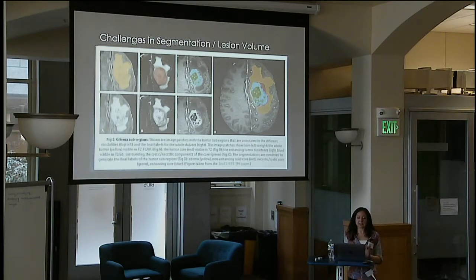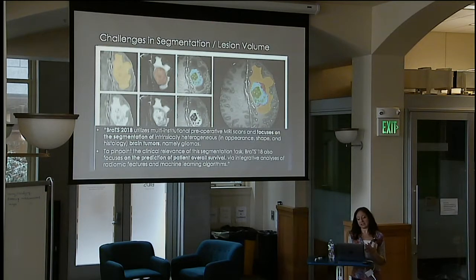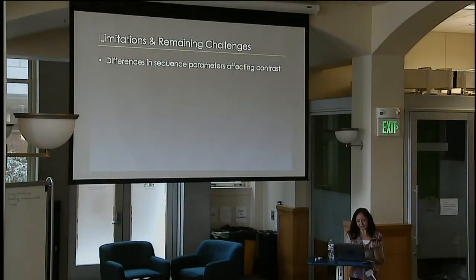But in the last, some of the limitations inherent in this is that the data sets that are used in these challenges are often limited, so that you have different sequence parameters affecting the contrast. So when you go beyond the certain data set and apply it to other institutions, the results often fall apart.